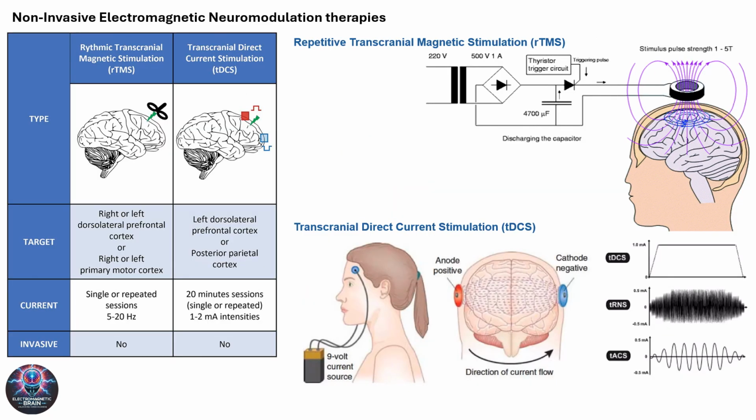In this slide, we dive deeper into the non-invasive electromagnetic neuromodulation therapies. These include two prominent techniques, tDCS and rTMS.